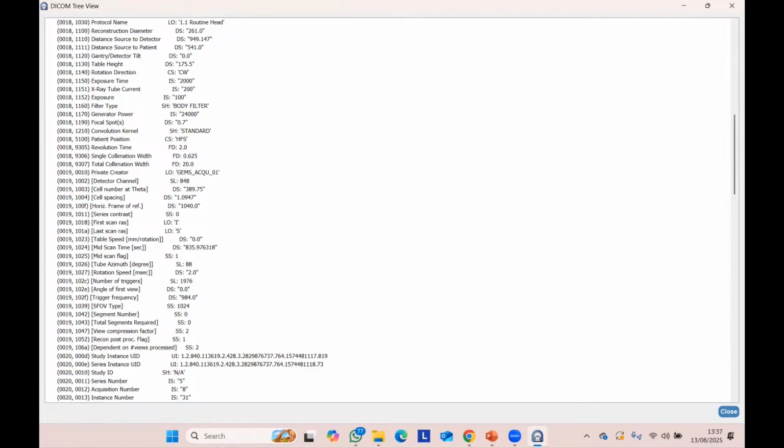Is there a way to measure the HVL values? Oh no. You can measure the half value layer using a detector, such as the RTI detector or maybe the Piranha detector. So using the IndoQCT, you cannot measure the half value layer. Okay.